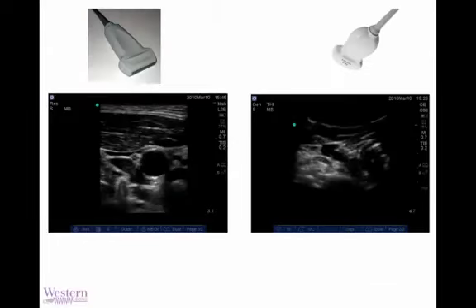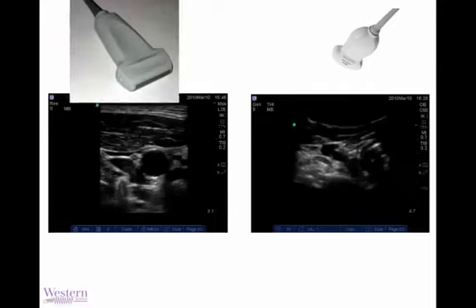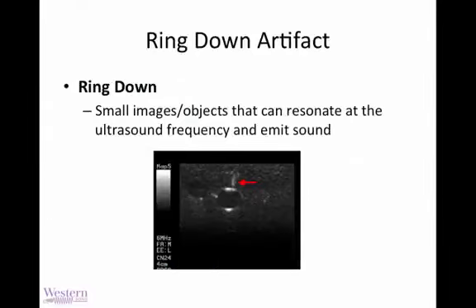By comparison, you can see on the right here the same vascular image, compared to this one here, obtained with a curved linear probe, though at a similar depth of 4.7 to 3.1 centimeters. The anatomic detail is really all but lost for a near-field structure such as these vessels. So we will always choose the linear array when doing ultrasound-guided vascular access.